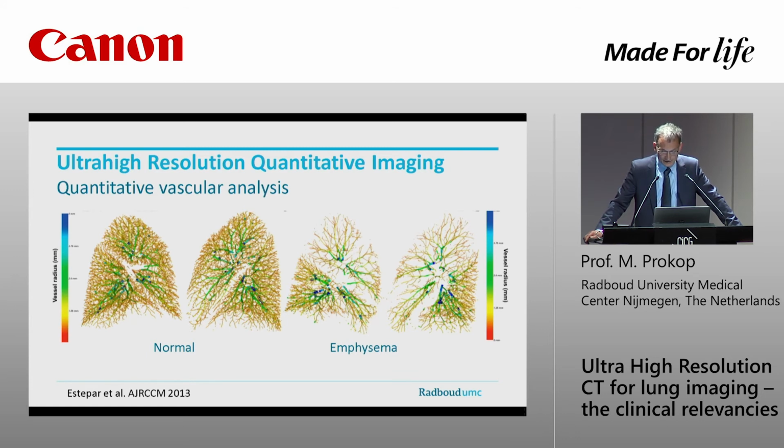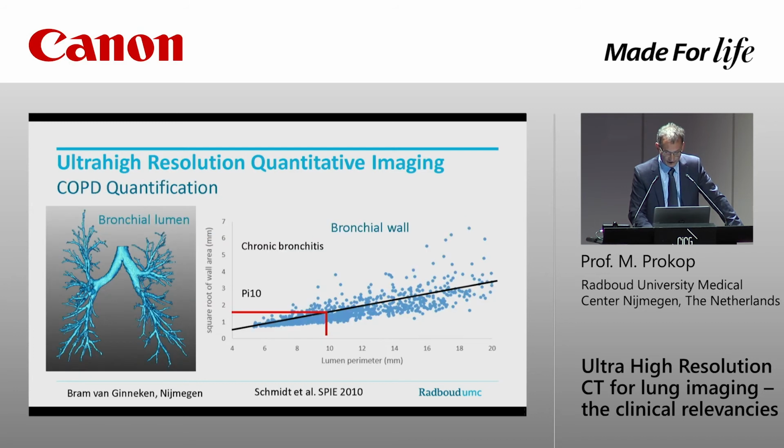And these vascular structures that we see here are probably going to become more and more important in the future, much more than we think now. And probably there we will see a lot of the problems that are going on in the lung, not so much the parenchyma itself, but the associated vasculature.